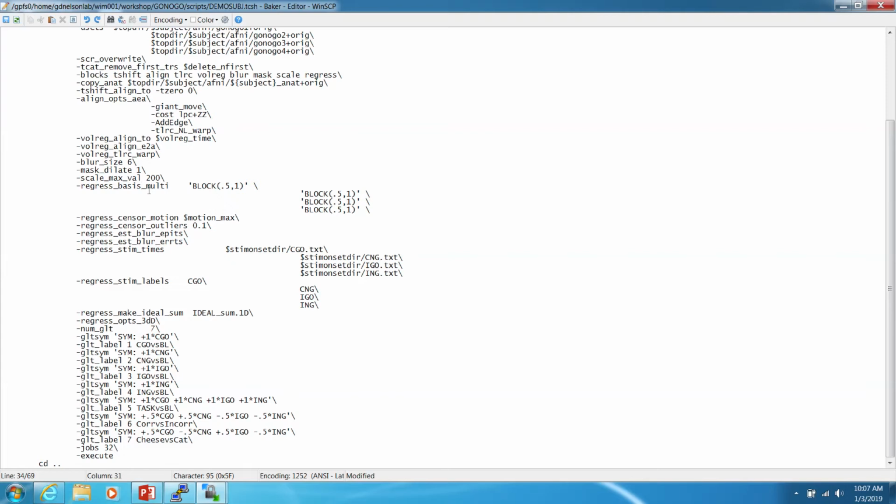And when you've got more oxygen heading to an area, that means that area needs more oxygen because it's doing more stuff. This is an oversimplification. There's nuance here, but when we're getting our signal out in our neuroimaging data, our fMRI data over time, we don't just see, oh, this event happened and then there's a big spike in oxygen.